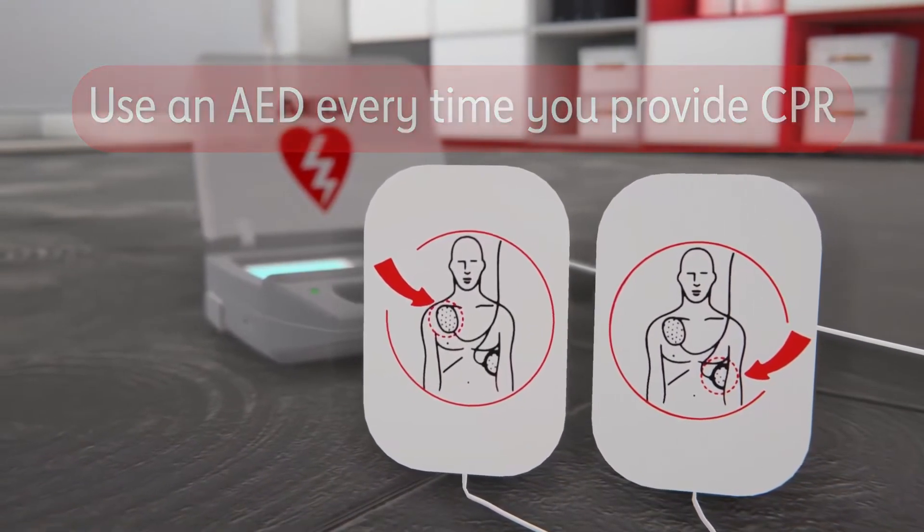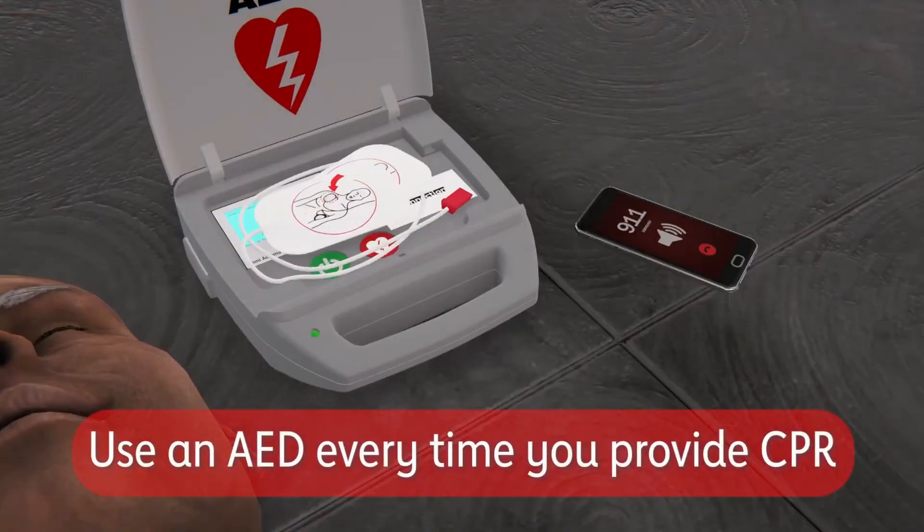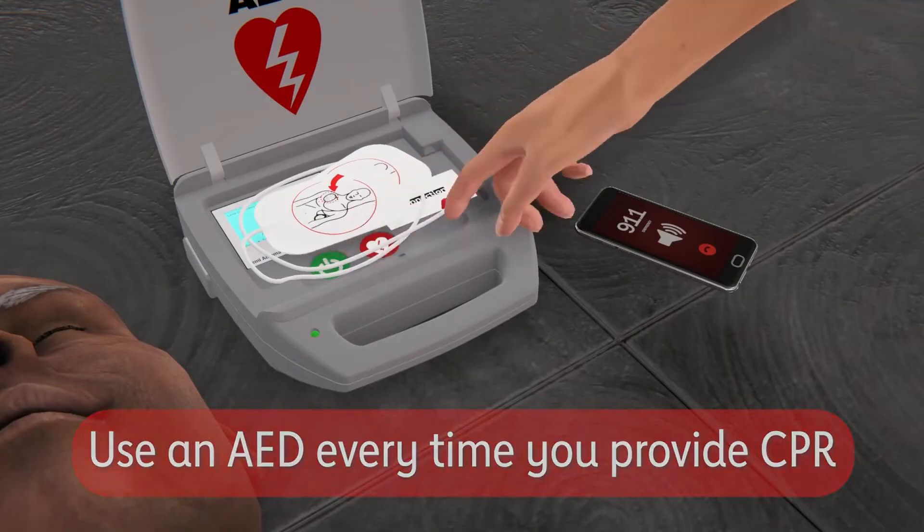If possible, use an AED every time you provide CPR. AEDs are safe, accurate, and easy to use.